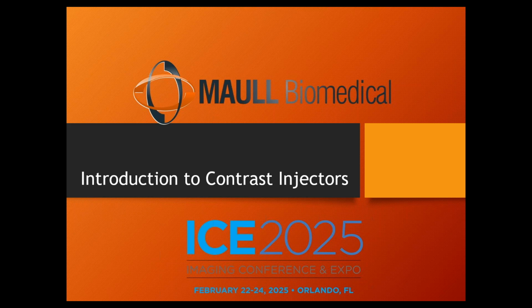So if you think about your typical radiographic image, it's a black background, and let's say it's a chest X-ray, you can see all the ribs and everything, and all the bones are white. That's because the bones are thicker and denser than all the soft tissue in the body, so the bones absorb the radiation. So those parts of the plate that are shielded from the X-ray photons by bony structure don't get any radiation. So that part of the plate stays white or nearly white. But the soft tissue lets the X-rays pass through it, those photons strike the plate, and turn those areas dark. So that's why the background is dark and the bony structure is white. Everybody understand?